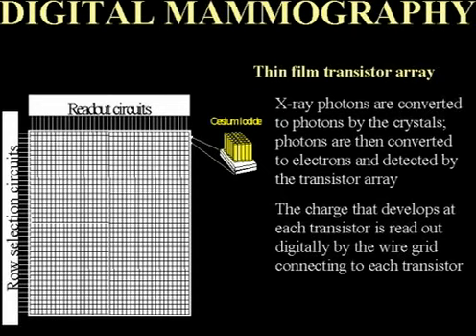Now you can see that this is an incredibly intricate detector design, and that explains why the GE system has a small field of view. It is very complicated to develop this any bigger than it currently is, and that has been the challenge in General Electric bringing a larger field of view detector to market. It's just simply the construct of their design is quite complex.